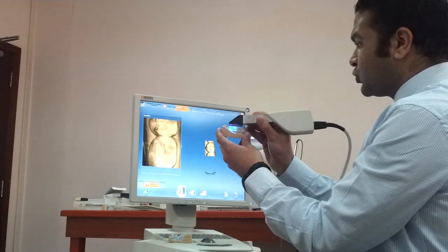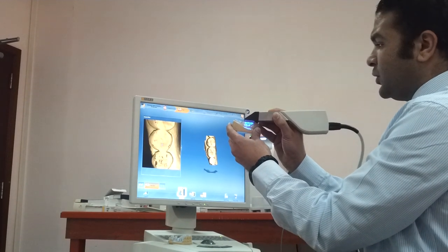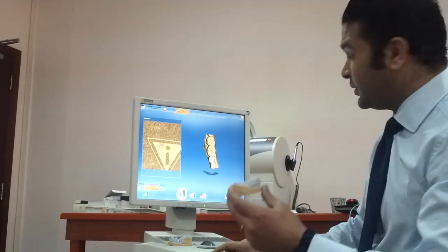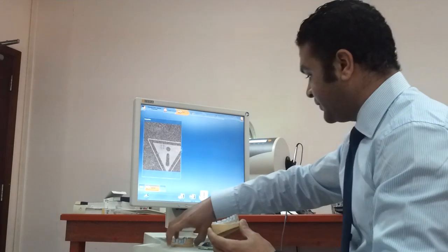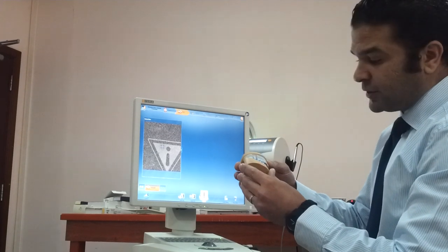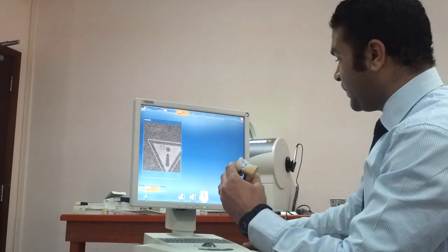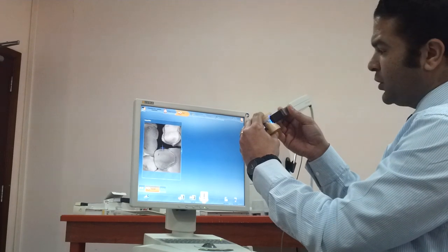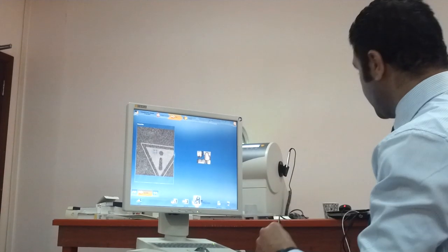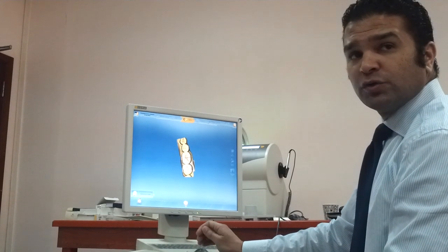The camera is an automatic, shake-free capturing camera. When I rest my hands on the occlusal surface of the patient's teeth, it takes the capture very precisely. Now I've taken the upper and lower jaw. I'll ask the patient to bite in centric occlusal relation and take a buccal shot to determine vertical dimension and bite. Now I'll press next.